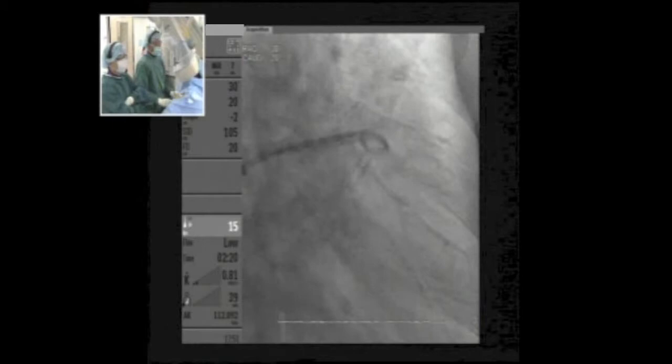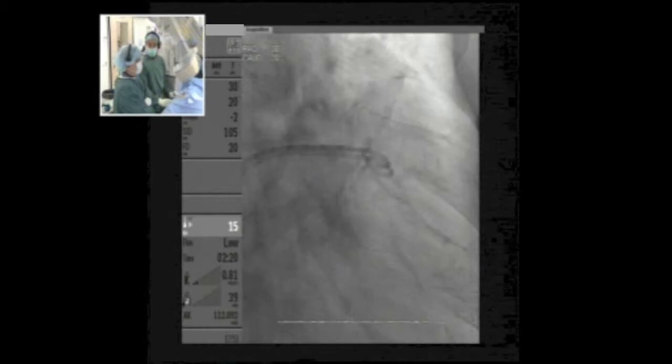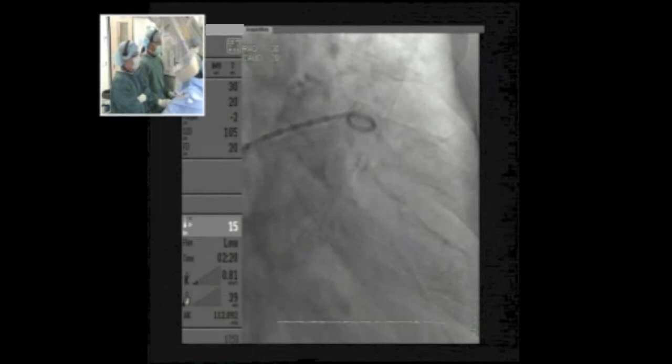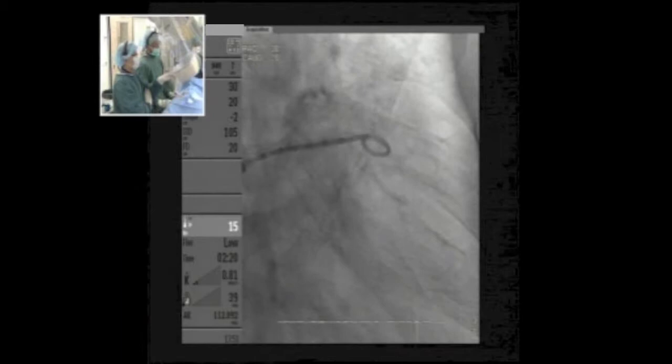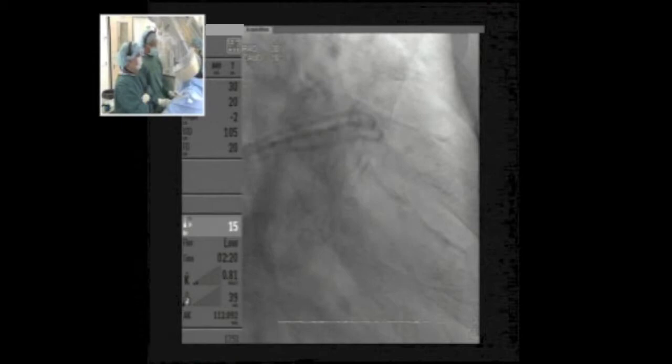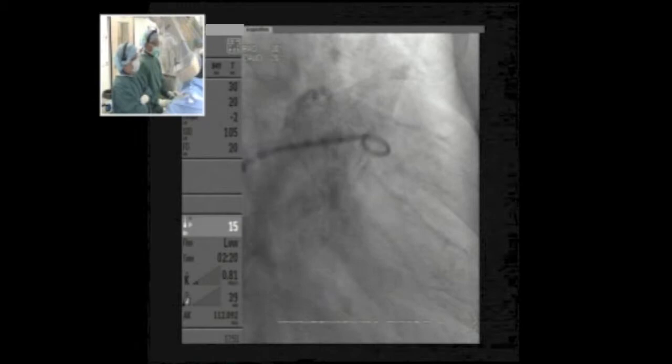One possibility is to do a power injection — typically I use 20cc at 10cc per second. This is a quite large appendage. In the caudal view, this can be misleading as it tends to be foreshortened. Looking at the marker of the pigtail, you can tell it is foreshortened. Measurements at this angle are often not very accurate.